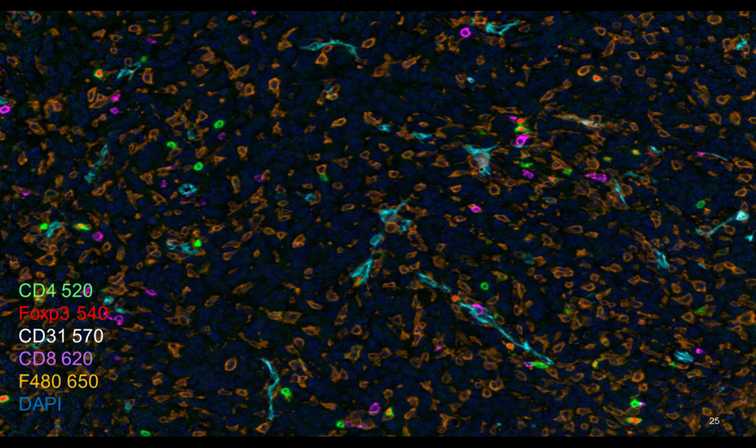There's nice staining, but in most of these samples, cytokeratin was ubiquitous in these sections. So at some points, it made it hard to read. So all we have to do is turn off one of the channels. So we turn off the cytokeratin channel. If we turn off the cytokeratin channel, we see some really beautiful staining of 5 biomarkers plus DAPI. OPAL works really nicely with mouse tissue.